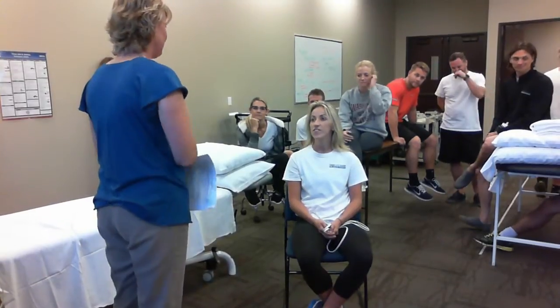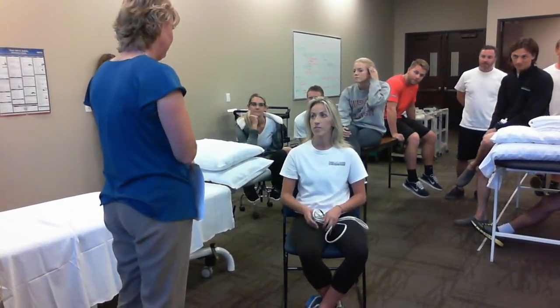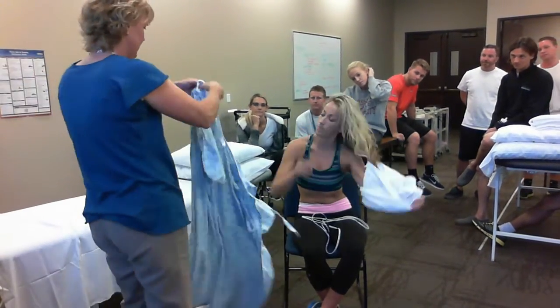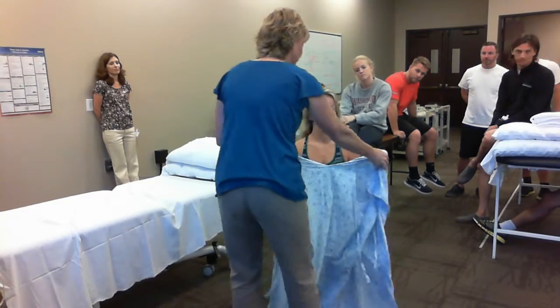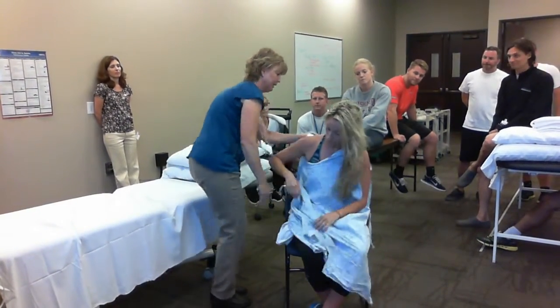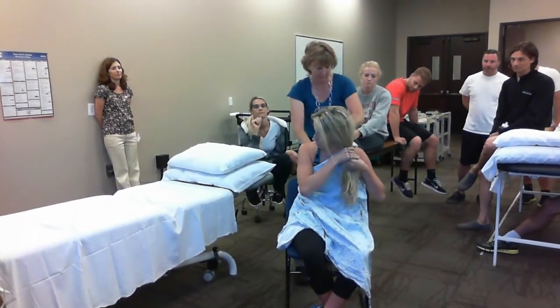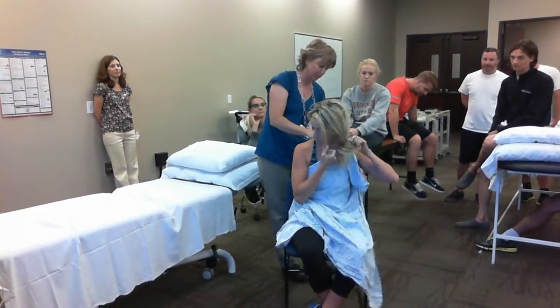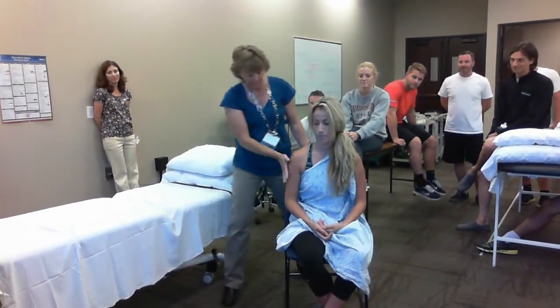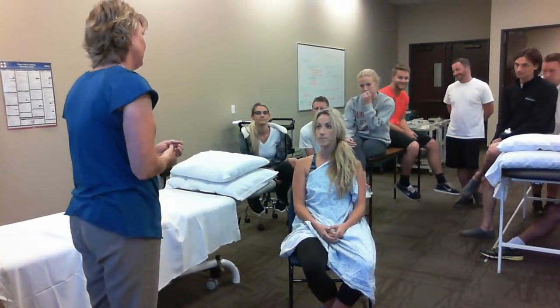this treatment. So what I'd like to do is just inspect the skin. So do you mind removing your shirt? And bringing up just your left arm in there. Thank you for putting your hair up. That doesn't hurt your shoulder, I hope. Okay. So I guess you've had a rotator cuff repair, so I'm going to lift it for you when it is time for me to position.